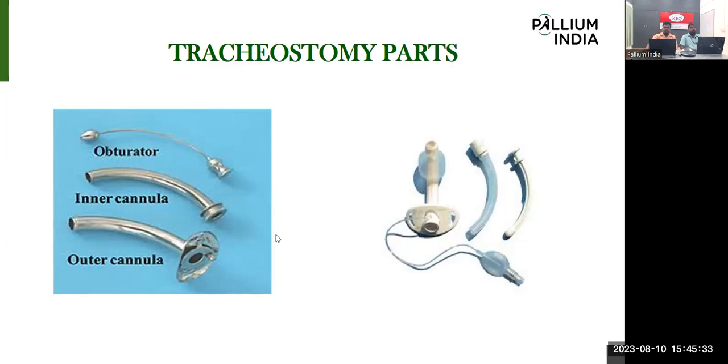Now I have another question. Comparatively, which cannula or which tube has more length? Inner cannula or outer cannula, which one has more length? Can anybody tell? Outer cannula.